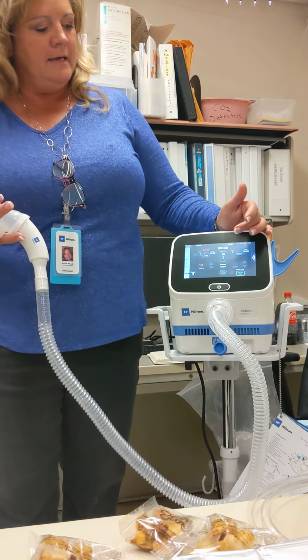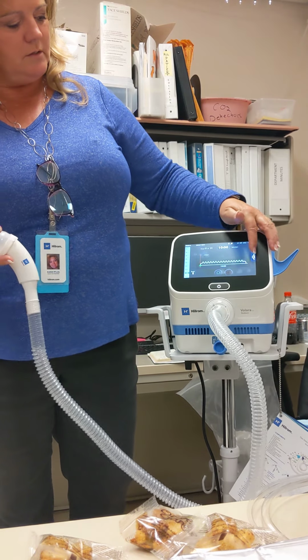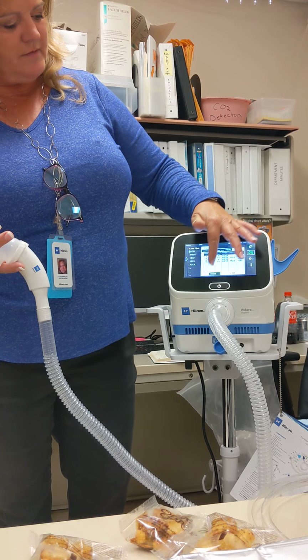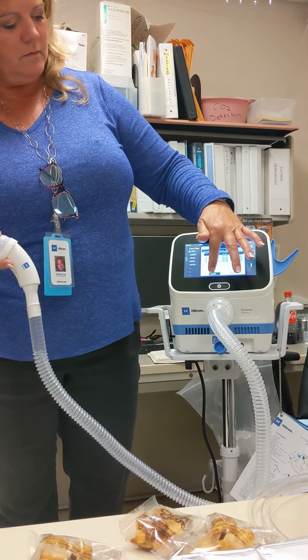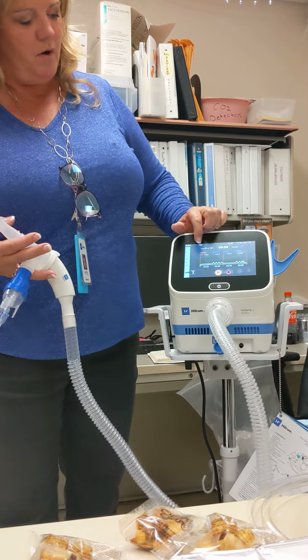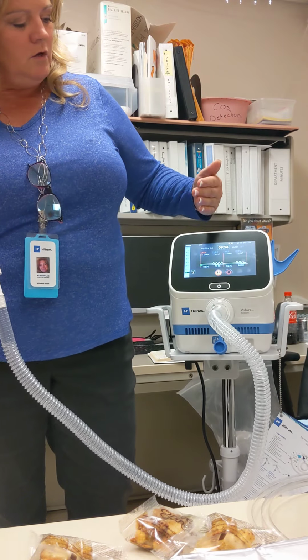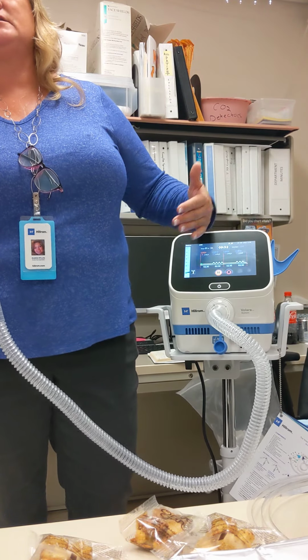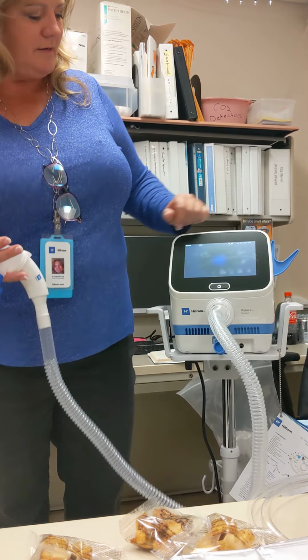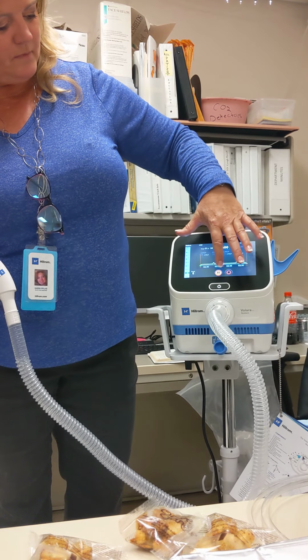The automatic mode is kind of nice because it gives the patient the view of what it looks like. It's like following the bouncing ball, instead of you manually going back and forth. You can program how many seconds, how many minutes per each one. You hit start. Whoops, I didn't mean to hit off. Sorry. That was easy.